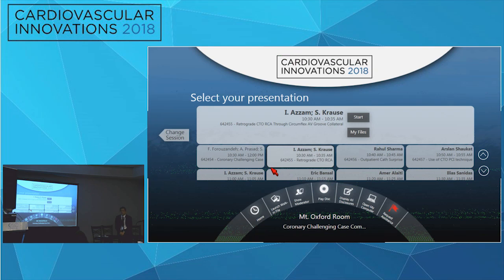Yep. Very good. As a final comment, just a point of clarification, this is not your first retrograde case, or is it?